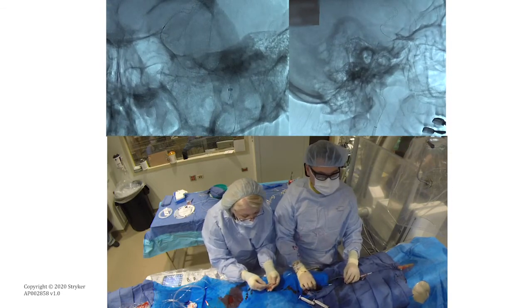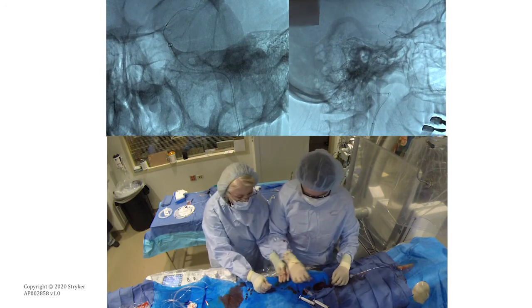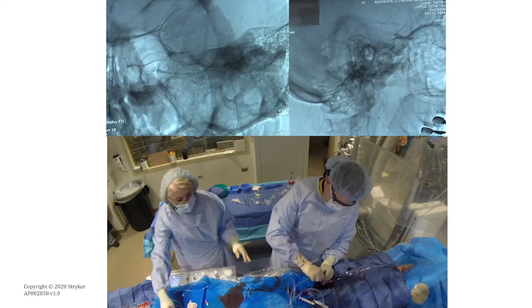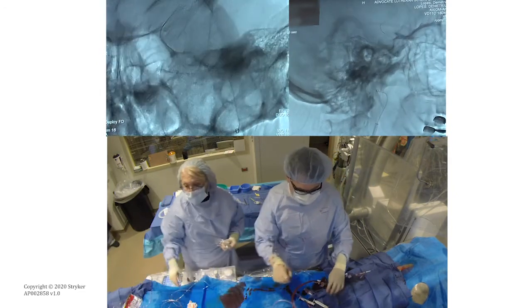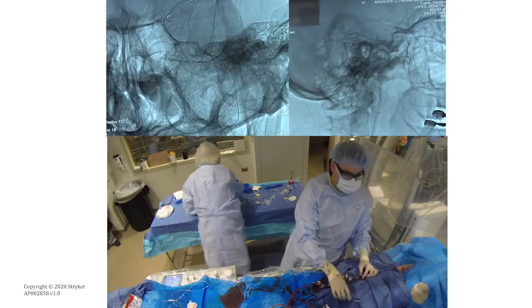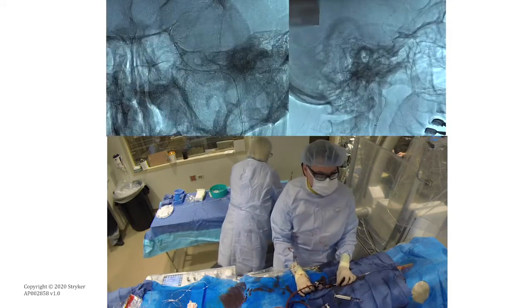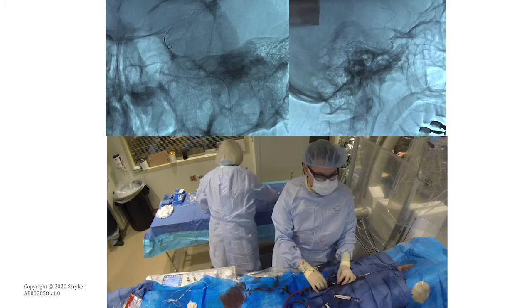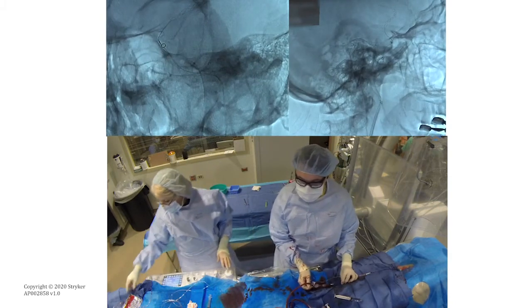The aspiration catheter in this case is a Cat 7, and we are in position, navigating to trap the clot between the stent retriever and the catheter. You can see here as the aspiration catheter goes up into the more challenging anatomy, which is the cavernous, we start to connect to the aspiration, and the aspiration starts just proximal to the clot, and then as soon as you stop seeing the aspirations, you have engaged the clot. So we now have a combination: distally you have the stent retriever, and then proximally you engage the clot with the aspiration starting just before you arrive at the clot.